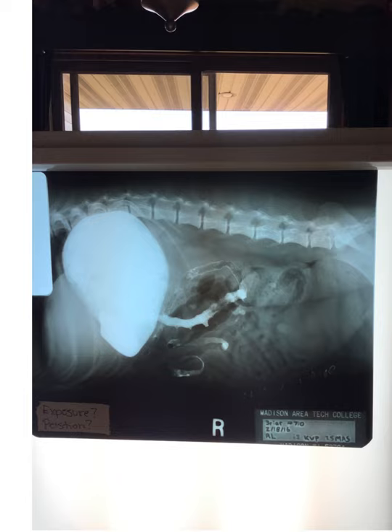So to start with, let's evaluate this radiograph on its positioning. If we're looking at our cranial landmark, we cannot see the full entirety of the diaphragm. It kind of comes here and it goes off of the screen. We also cannot see the apex of the heart. What I do like about this one is showing why it's so critical. If we don't have basically that full diaphragm, we'd be missing this whole area of the stomach.